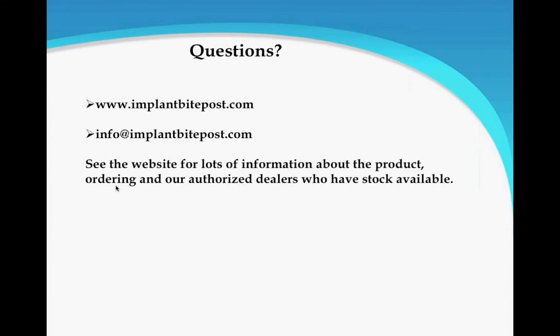I'm not quite sure I understand the question, but we're using these in a bite registration and not so much in an impression situation. The impression, I mean, I always 100% of the time do an open tray impression, so that has an open tray impression coping, which locks into the impression, and then you just unscrew it, and then it stays in the impression. So the implant bite post is used for bite records only.